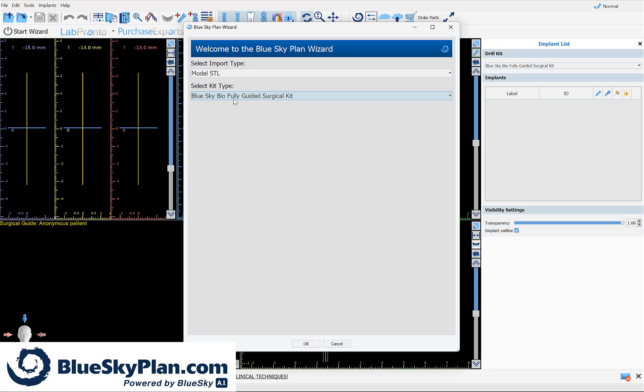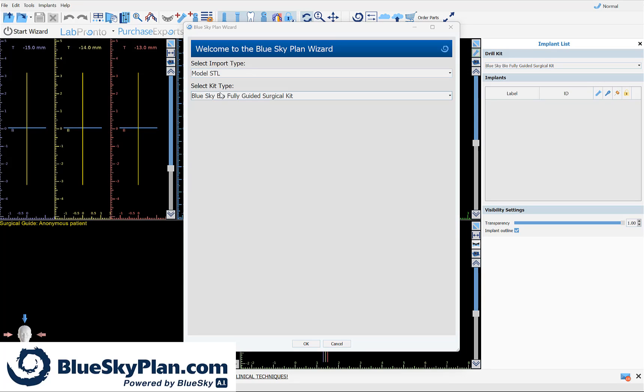At no point will you be prompted to enter any measurements or specific information regarding the surgical kit, the drilling depth, or anything else. Now that you have the import type selected to model STL and the kit type selected to Blue Sky Bio fully guided surgical kit, go ahead and click on OK.